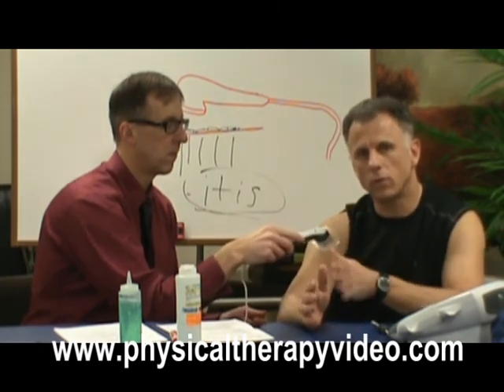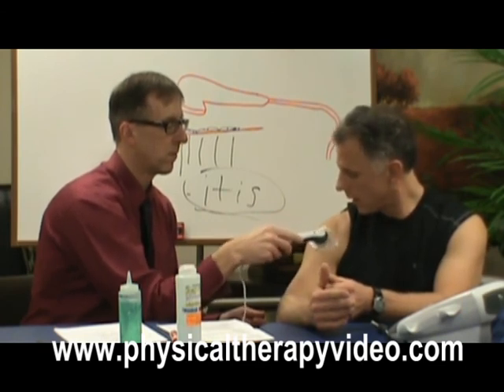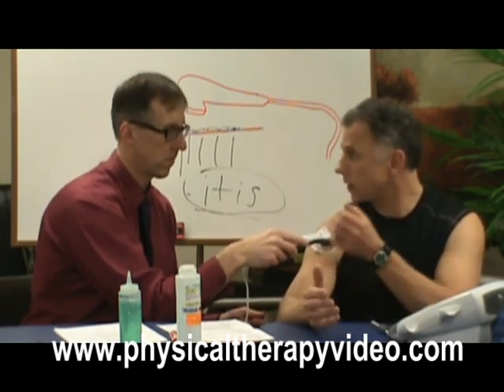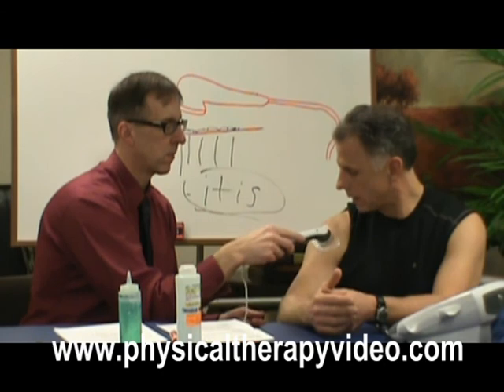One thing I wanted to say while you're doing this: this is usually a 7-minute treatment, and it will actually heat up the tissues as well. As the sound waves go through the tissues, it vibrates them, your cells rub together and create friction, and that's how heat is produced with this treatment. So there's the thermal aspect of it, and the mechanical aspect of the vibration, which gets things moving to help get the medication in, and of course with the ketoprofen, the actual anti-inflammatory.